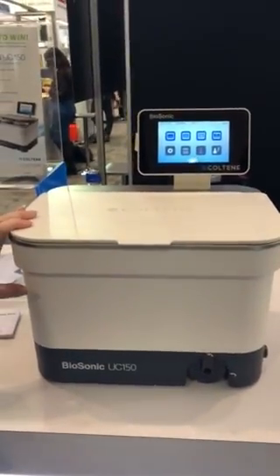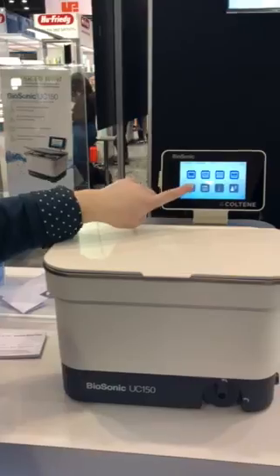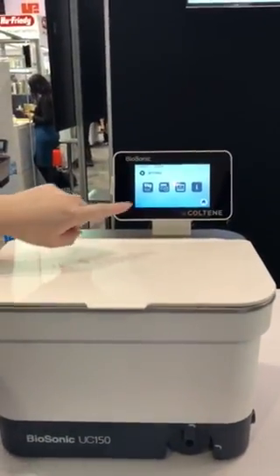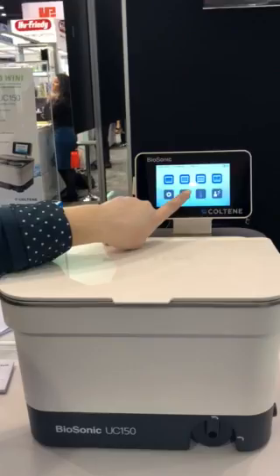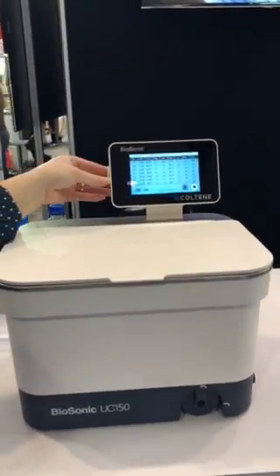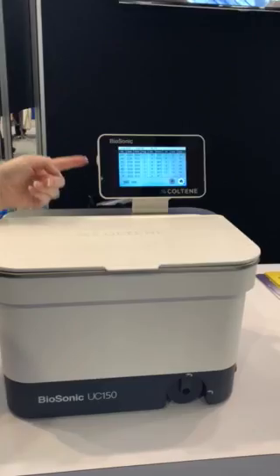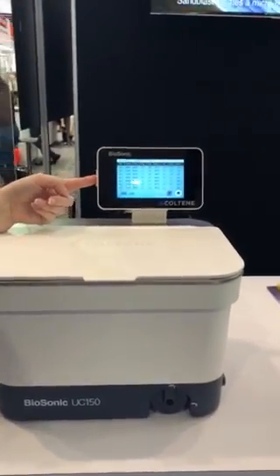This is Colteen's latest ultrasonic cleaner, the UC150. The updates to this unit are the digital touchscreen — it operates with a gloved hand. The best thing about this unit is the cleaning data download. You put a jump drive right in here and you can download to an Excel spreadsheet, so no more manual cleaning logs needed.